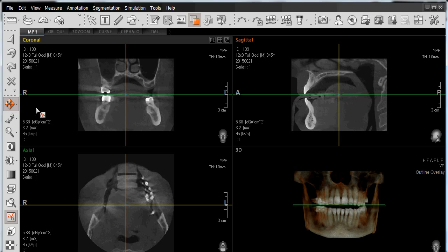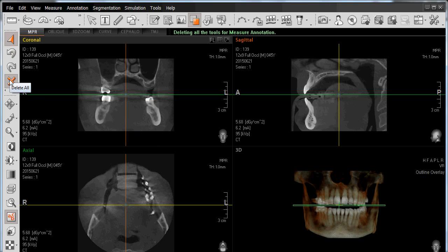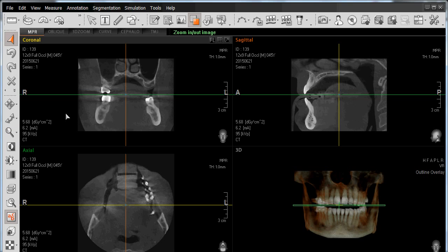To terminate a function, it can be performed in one of two ways. Position the mouse on top of the icon at the top that says Select, left-click, and it will terminate that particular function. You can also terminate a function such as zooming by simply clicking the Escape key on your keyboard.